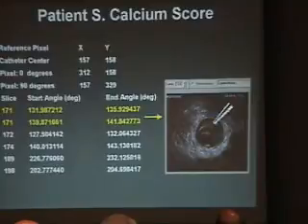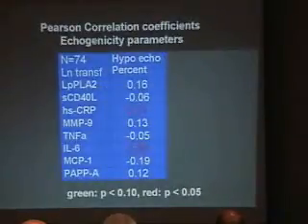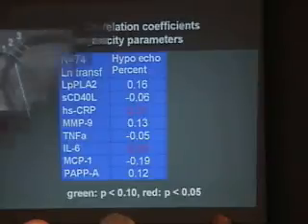Now, just this slide to show you that we go into great detail, defining the arc and the length of the arc of these small pieces of calcium with IVUS. But the interesting point, before going back to the multi-slice CT scan, is that when you look at these biological markers, at least two of them correlate in some way. I recognize that the Pearson correlation coefficient of 0.31 is weak, but at least it correlates with the CRP and with interleukin-6. In other words, hypoechogenicity is in some way statistically related with these parameters.